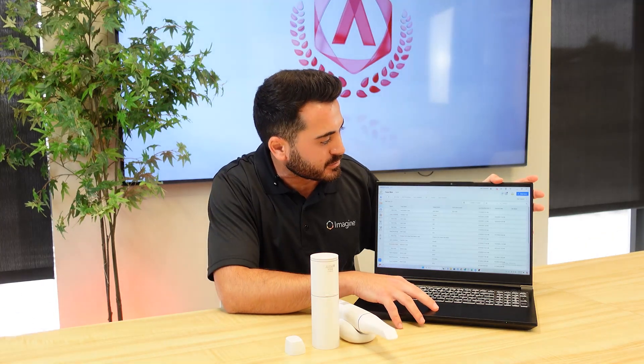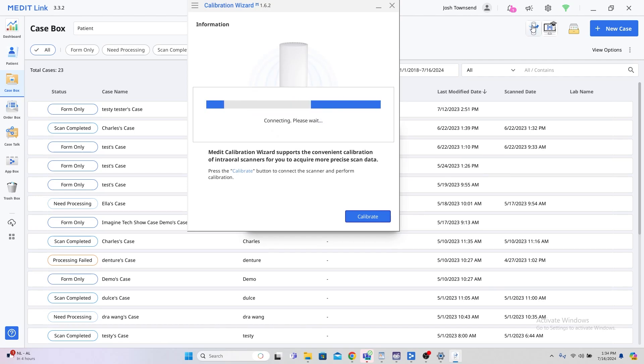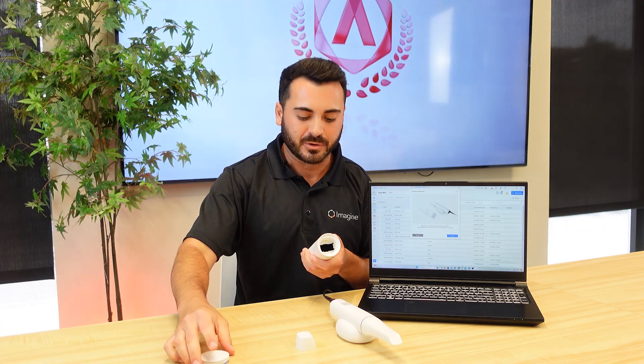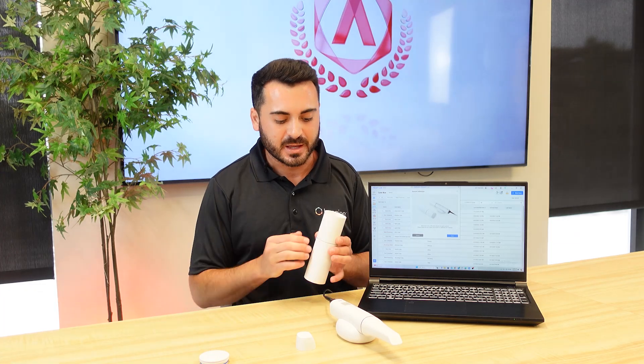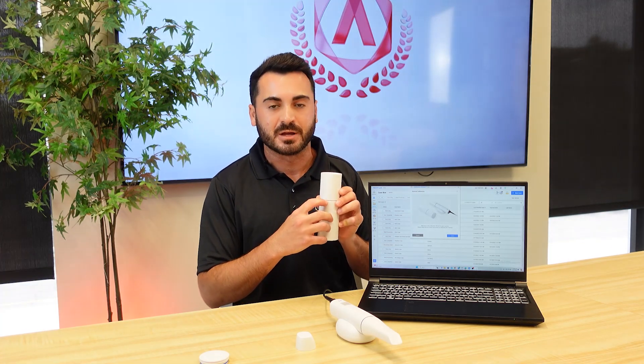Now we're ready to start our calibration process for the scanner. We're going to do this by first selecting the calibration app icon in the upper right-hand corner of your screen. Upon selecting the app, the scanner will go through an initial connection period followed by a set of prompts for the user to follow. In these prompts, it'll instruct you to first remove the cap from your calibration tool and make sure that it is perfectly aligned.